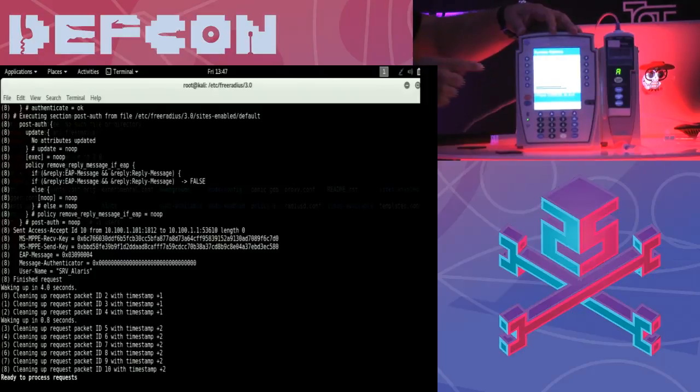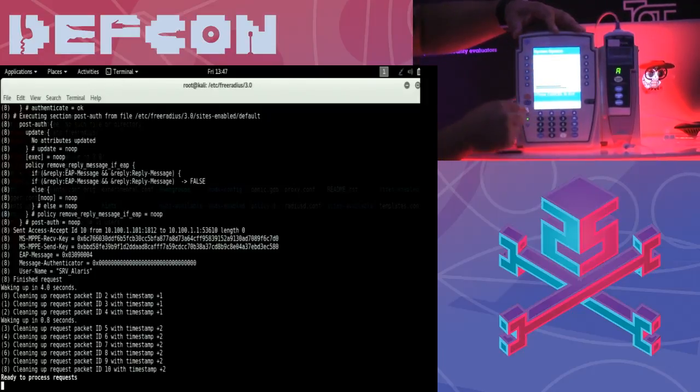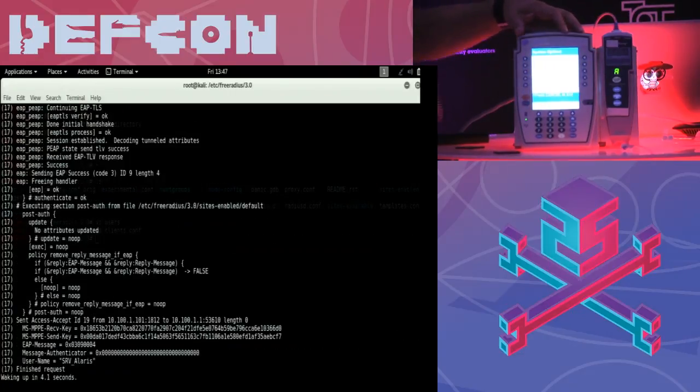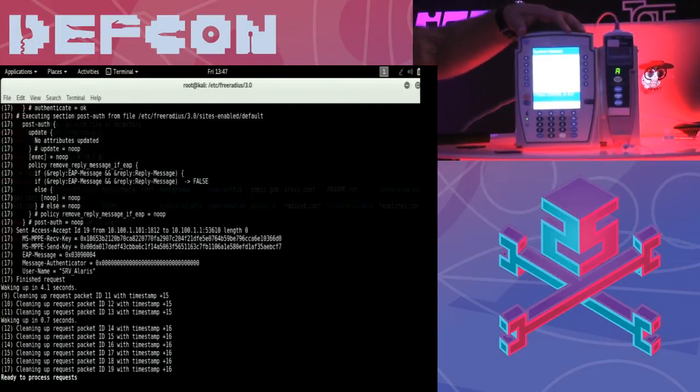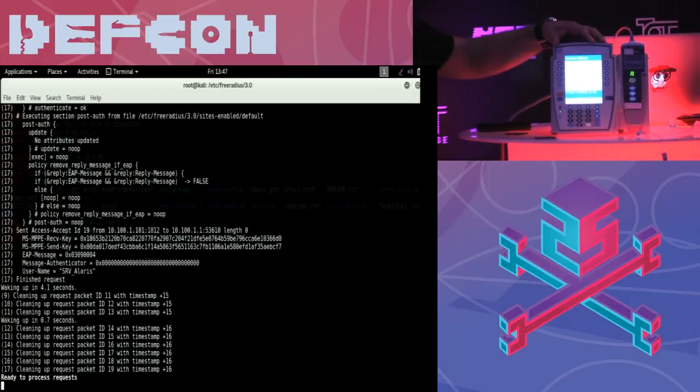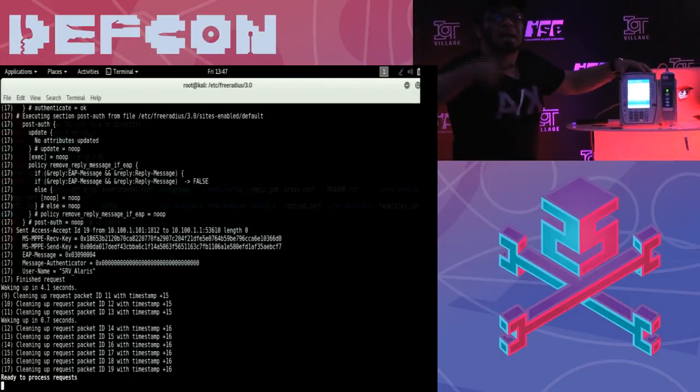You see that here? It says associated, and now let's go to the net address, and I got an address that I assigned to the pump. So at this point, it is not stable. You can see it is flipping. It's going to get the IP once again and again because it is trying to connect to the server. Since it is not the server, it's trying to authenticate again and again and again.